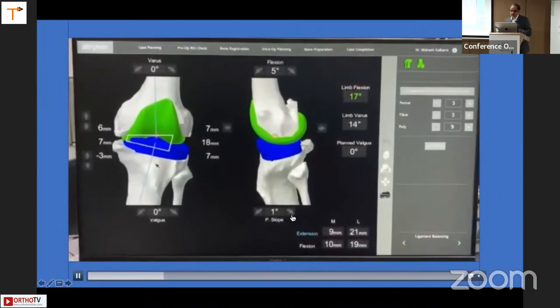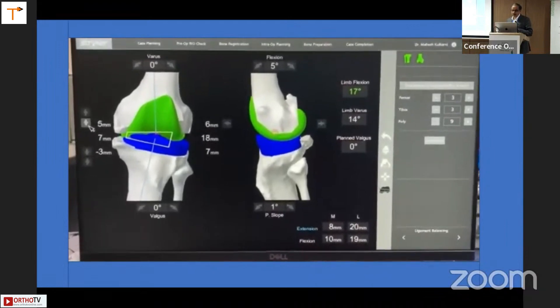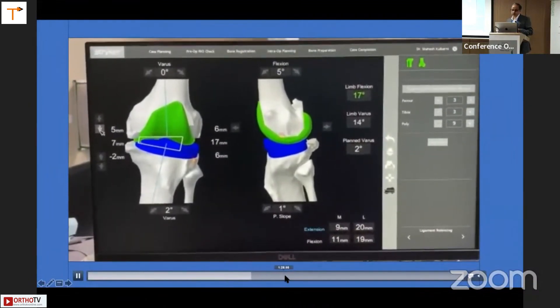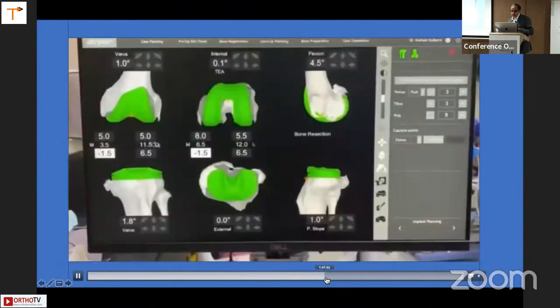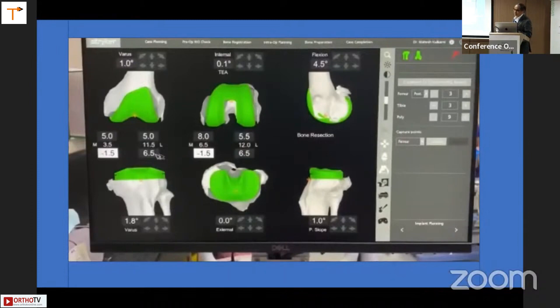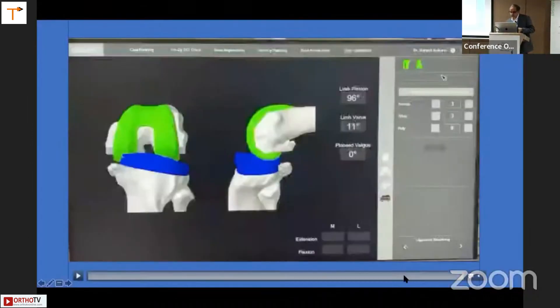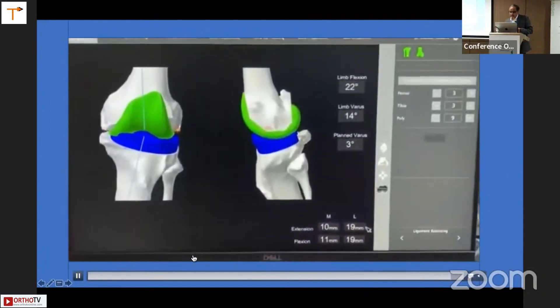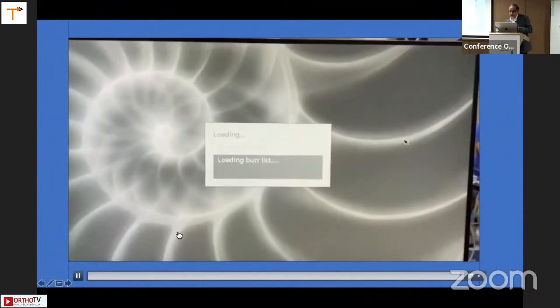Mahesh is here distalizing the femur and also the tibia. All conventional techniques for varus laxity correction or varus deformity correction remain applicable. For example, on this screen you can see a big osteophyte still present medially — because it is a CT-guided system it gives far more detail. The femoral and tibial components are both at size three, and I still have the option of going to size two, lateralizing the tibia, combined with reduction of the osteophyte on the medial side, which will take care of the medial tightness being shown. All manipulations are possible during surgery.